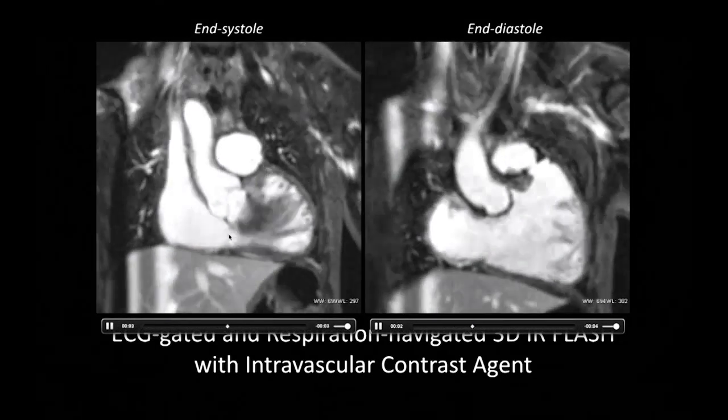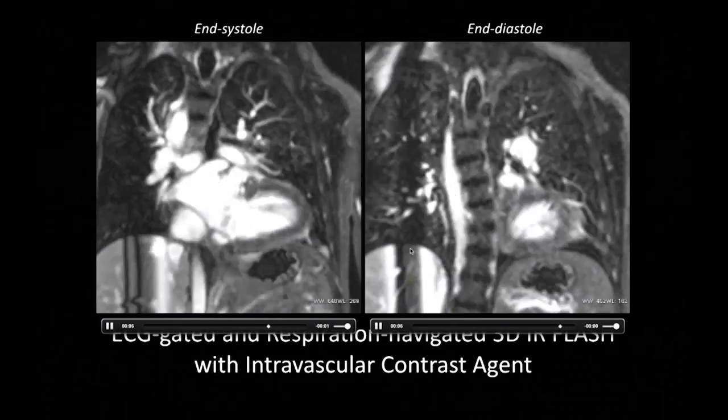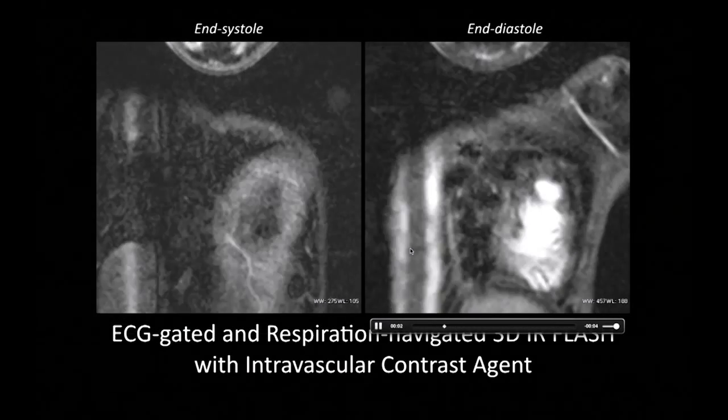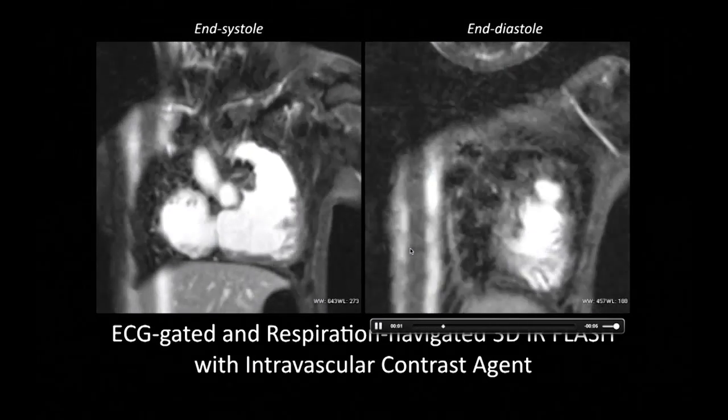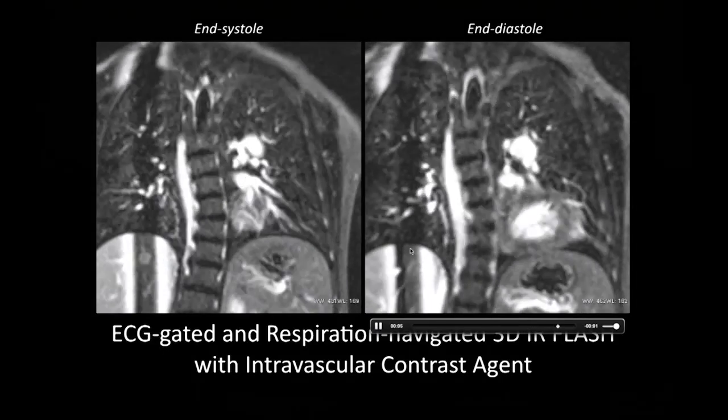This is targeted in systole. This is targeted in diastole. The anatomy is all there. Although it takes about 7-10 minutes to acquire such images, you don't have to worry about anything, and you have your full anatomy ready to show.